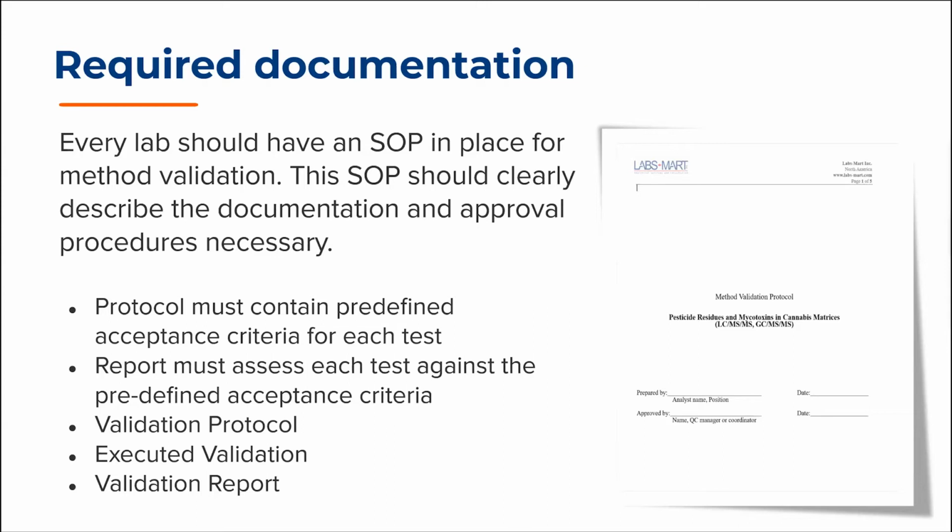Well-written validation protocols will also provide explicit guidance on how samples are to be prepared for the validation. For example, a well-written protocol will not just declare that 5 concentrations must be examined to determine linearity, but will detail the target concentrations for each of the 5 points in the linearity. This will minimize the chance of failure during the execution of the validation, which ultimately results in re-execution, wasting time and money.